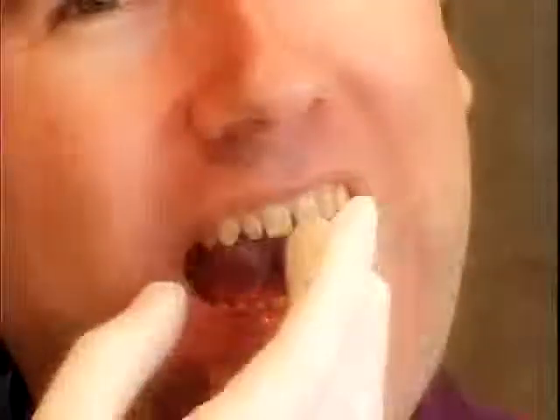You'll note that the coloration of Randy's teeth is one of his concerns, and the spacing between the tooth structure is yet another. In a moment I'll be laying material across the tooth structure to show what it would mean to close out the spaces and to recreate the smile on the top. On the bottom we'll probably do some consideration of using Bright Smile, so occasionally I mix different procedure types to maximize the results with the least amount of effort. The purpose of a simulation is to present the possibilities in terms of scale, in terms of closing spaces and redesigning shapes of teeth. Coloration will be partially addressed. Final results can be visualized by clicking on Lumineers.